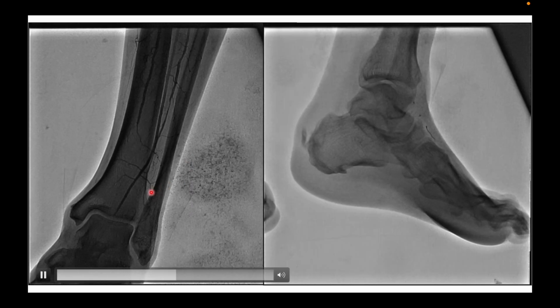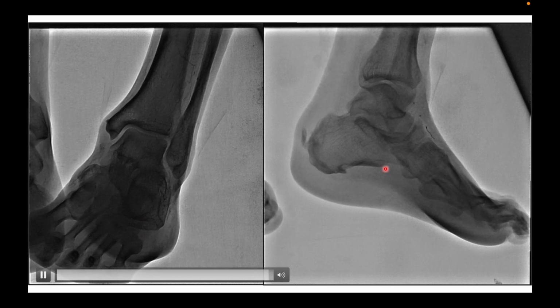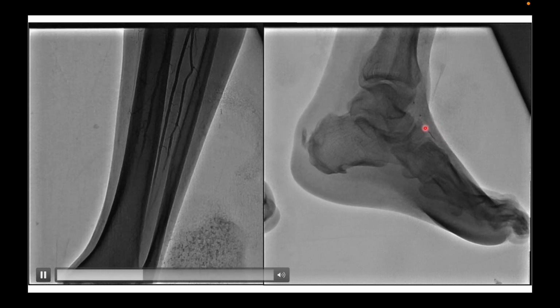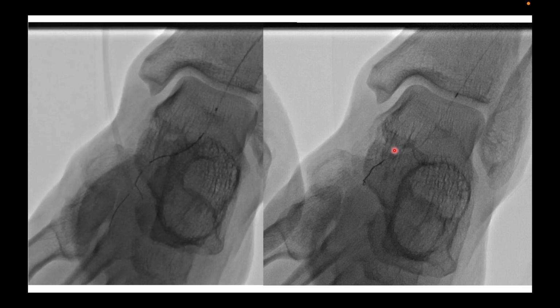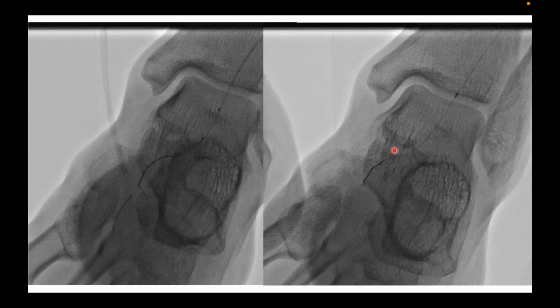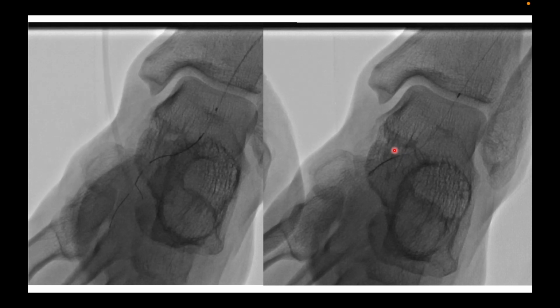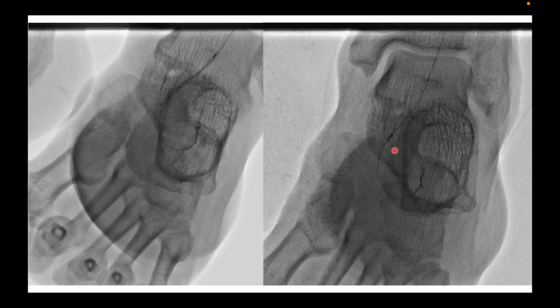This is a case where both the anterior tibial and posterior tibial are occluded distally, and I went in with my wire and the support catheter. I was able to cross in, but then my wire tip broke here, and it's the same retrieval situation as we do in the coronaries. I brought in two more wires, and between the two wires, I'm now trying to twist the other end. The proximal ends are through a torquer, and I'm twisting the broken tip between these two wires.